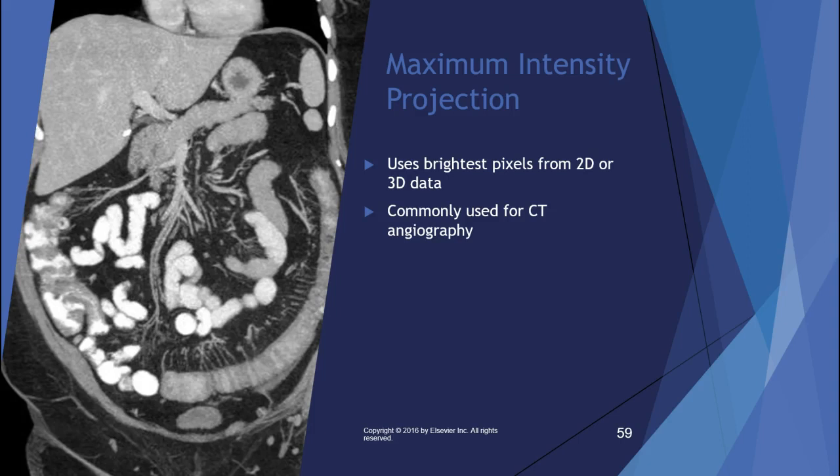And you tell it you want it in the coronal plane and you want it to be at 5 millimeter thick slices, so you want 20 slices. And it comes up with 20 coronal slices. It just takes the data, it compresses it all, and gives you your coronal images that you want. So those are called maximum intensity projections.